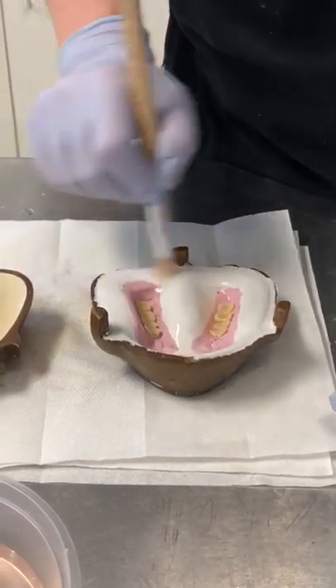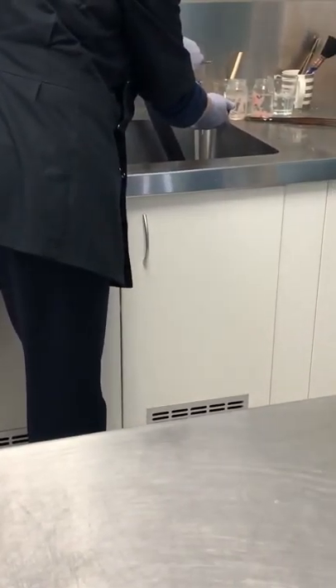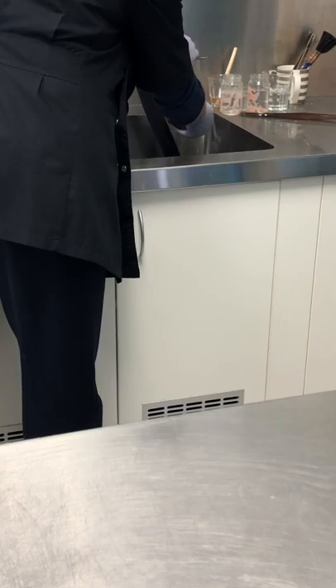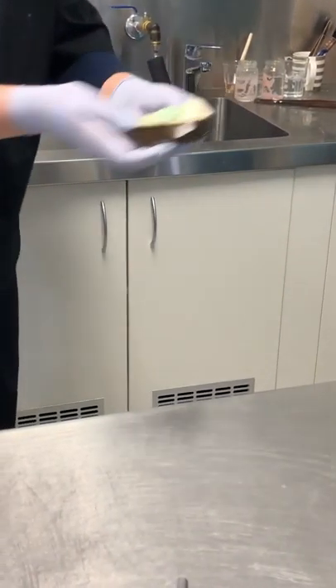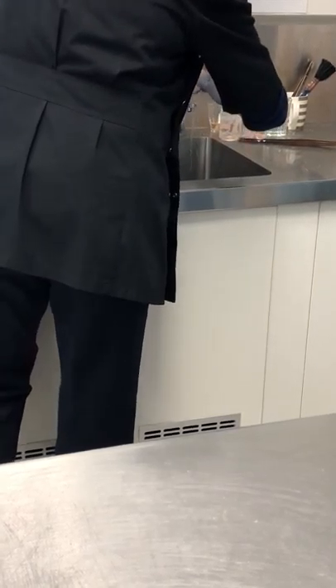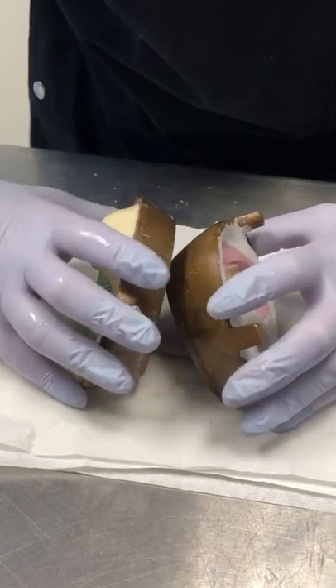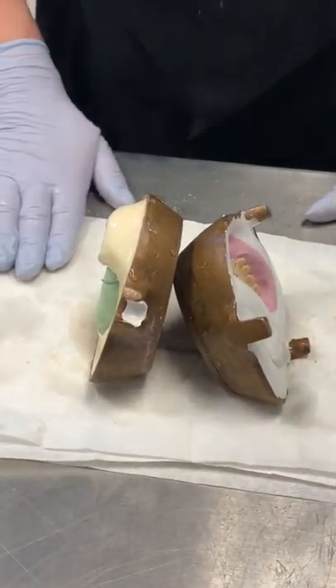And then when you've got enough separating solution on there, I just like to rinse off the excess under cold water. Then I'm just going to allow my flasks to dry whilst I prepare my acrylic.